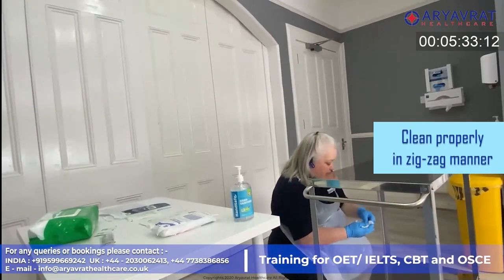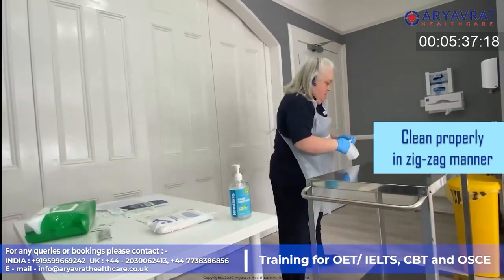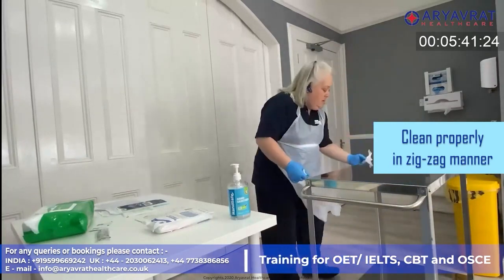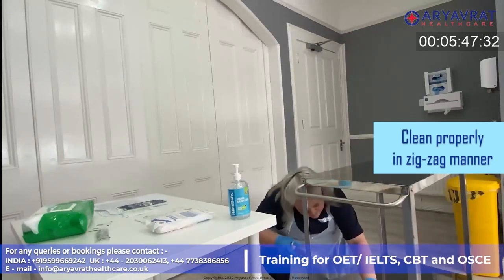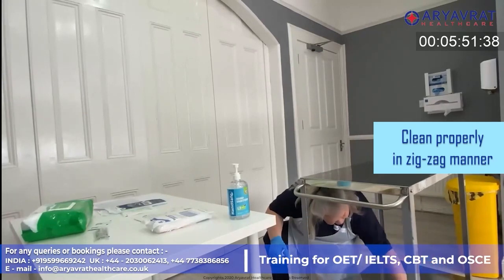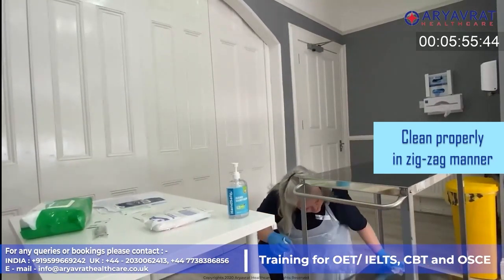And taking my next wipe, discarding that one, I'm going to clean the front legs, turning my wipe over and cleaning from the furthest to the nearest in a zigzag.